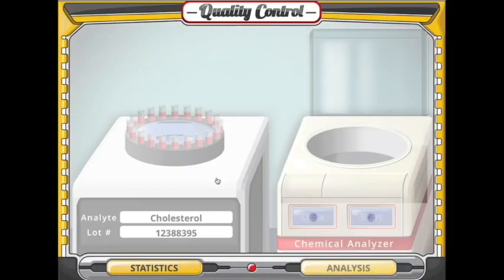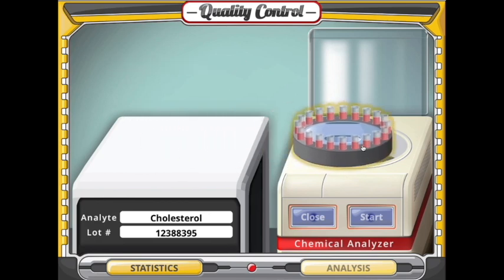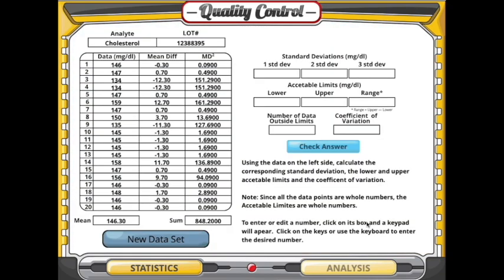Select the circular rack of test tubes containing laboratory samples and drag the rack to the open chemical analyzer. Select the Close button and then the Start button to analyze the samples. The new screen provides the name of the analyte along with the lot number. The screen also displays the results of the 20 test tubes analyzed.